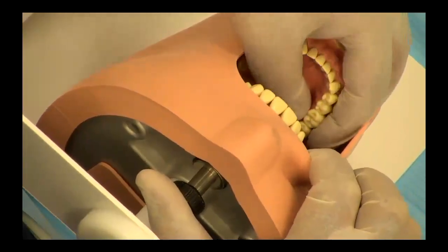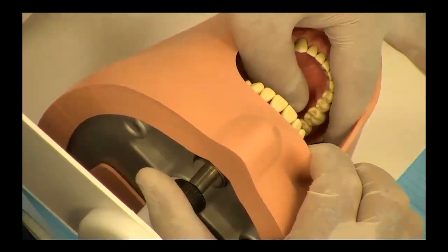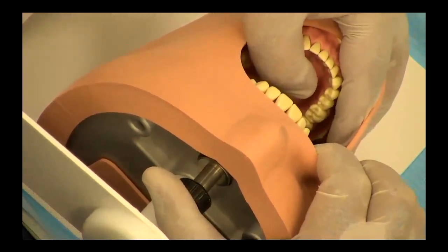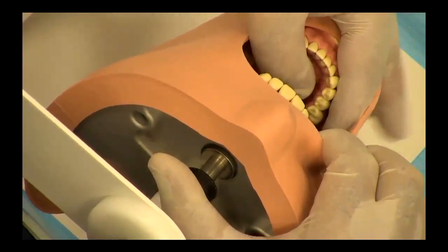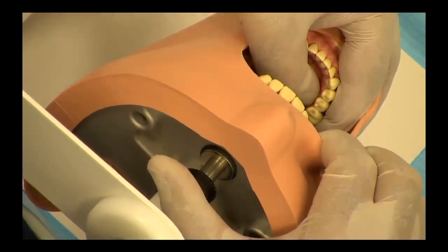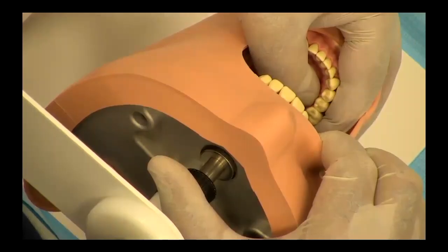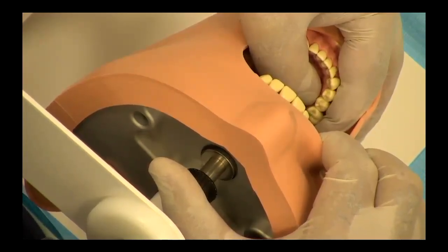That's how it will work. Thumb on the lingual, forefinger on the buccal, and the remaining three fingers supporting the mandible, as you can see. Can you see my fingers moving? They're supporting the mandible. So that's the position of the non-dominant hand for the mandibular right posterior quadrant.